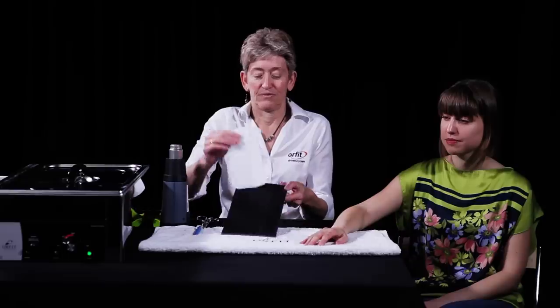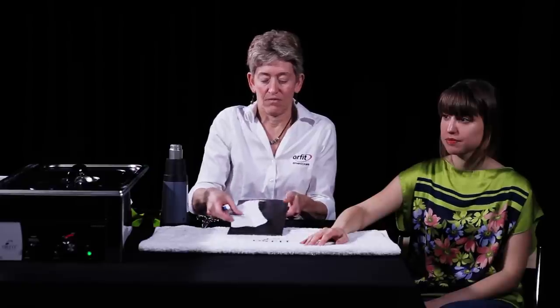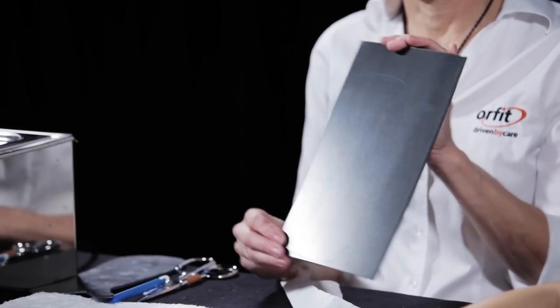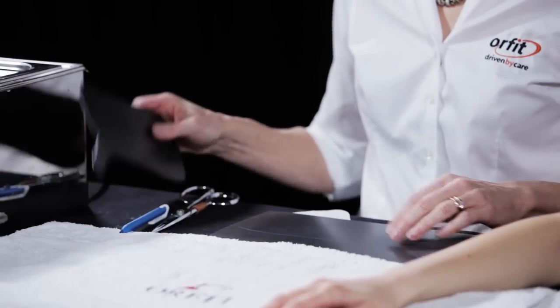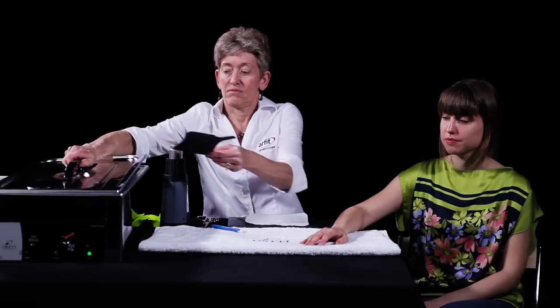Draw the patient's hand on a paper towel and make a pattern of the orthosis, which is then traced onto the thermoplastic material. Cut out the orthosis and place it back into the hot water to completely soften.